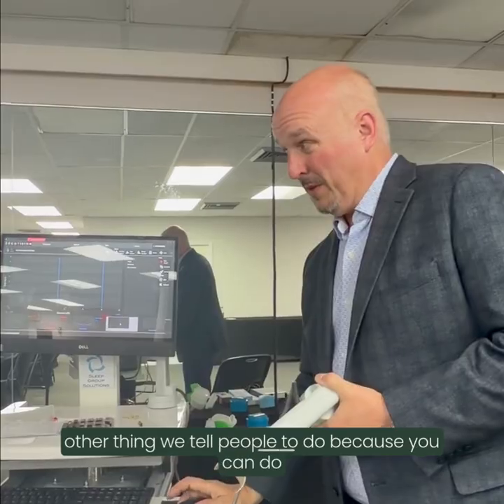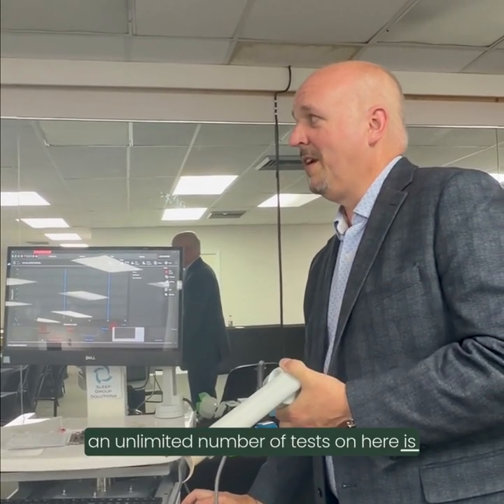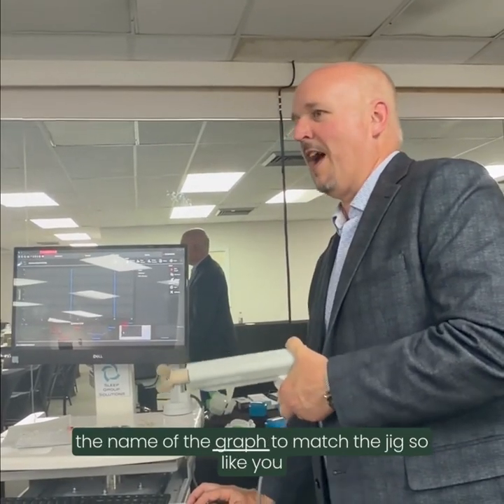The other thing we tell people to do, because you can do an unlimited number of tests on here, is as you try these new positions, change the name of the graph to match the jig.